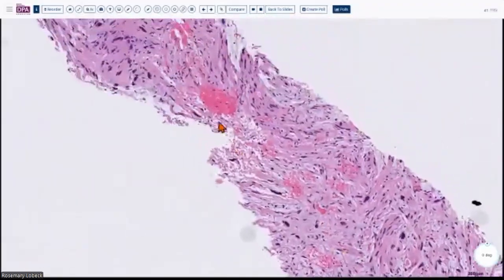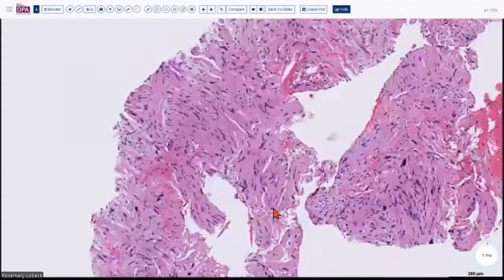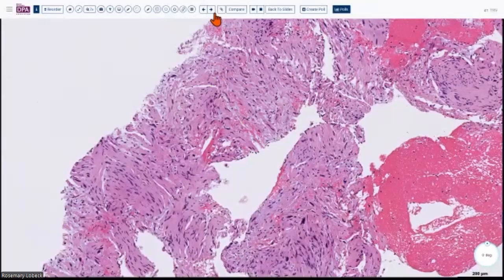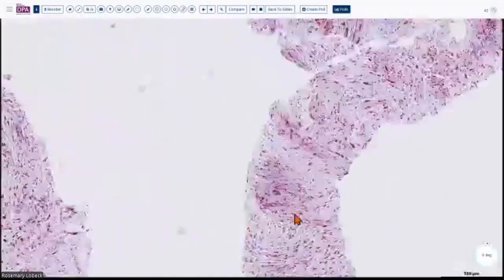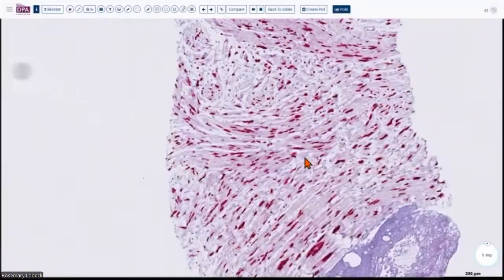And it's not just focally seen. Throughout the lesion, you go anywhere, you're going to see these nuclei, right? But most of you know the answer for this one. I'm going to reveal it right here. So when you do this particular immunostain, you know exactly what we are talking about, right? It's a diffusely strongly positive S100. This is nothing but a schwannoma with degenerative or ancient change.